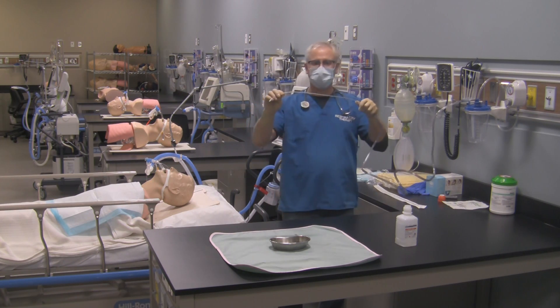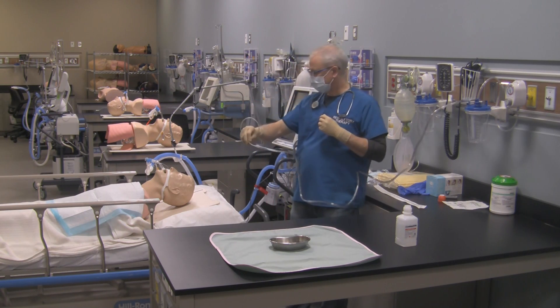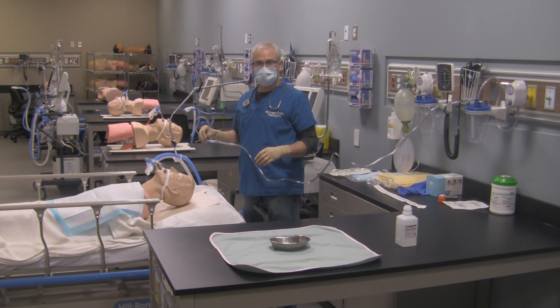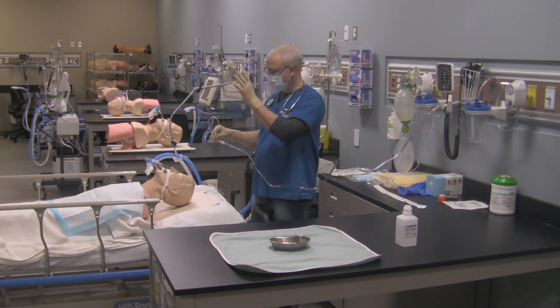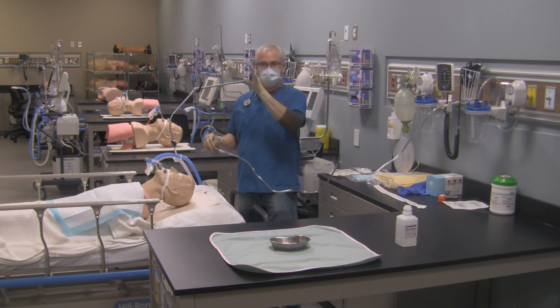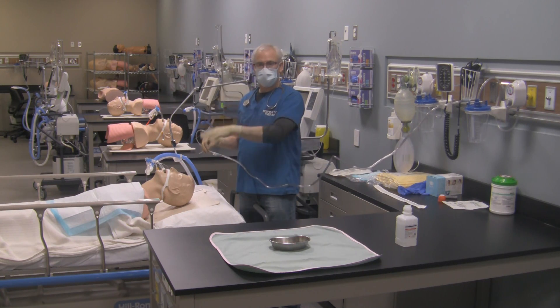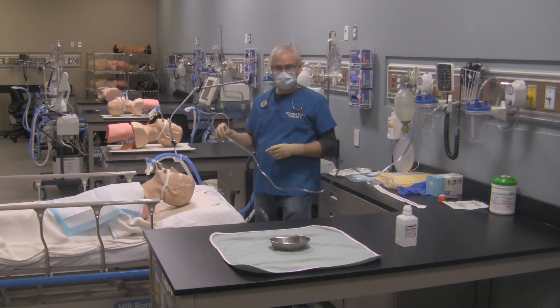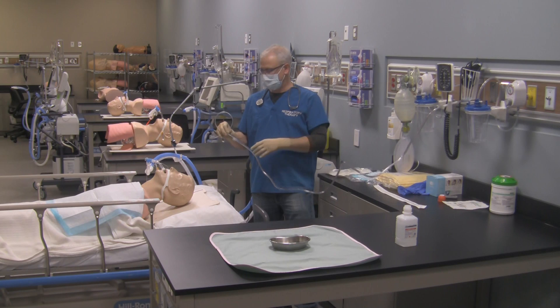Now I can suction out my patient. To suction out my patient properly, I usually loop my catheter like so. I'll then go over and disconnect the patient from the endotracheal tube — the ventilator will either be running or put into standby while you're doing this. Make sure your vital signs on your patient are stable, and of course you've already assessed your patient so you know they need to be suctioned. Tell the patient you're going to suction out their airway.